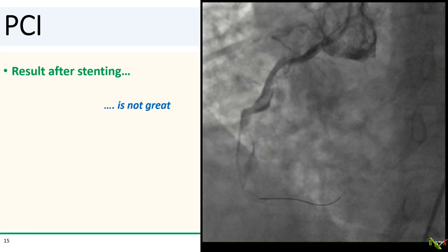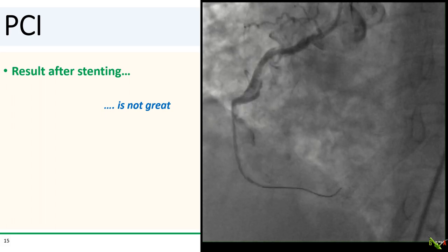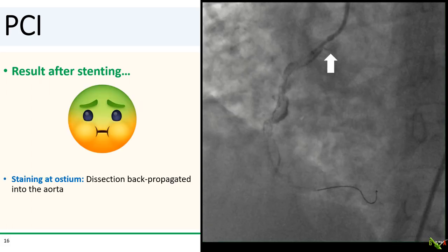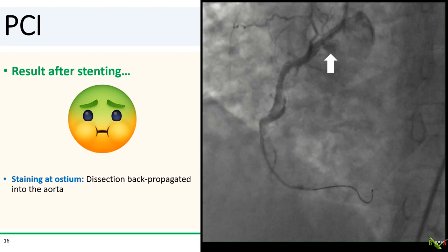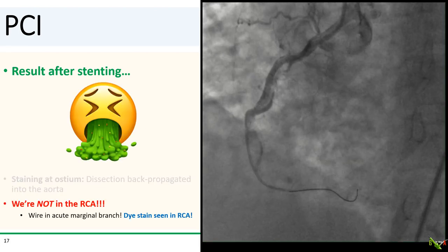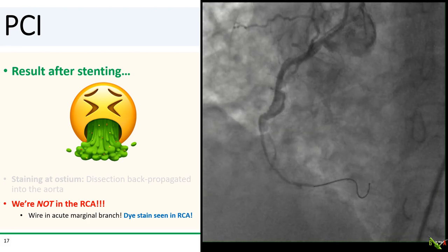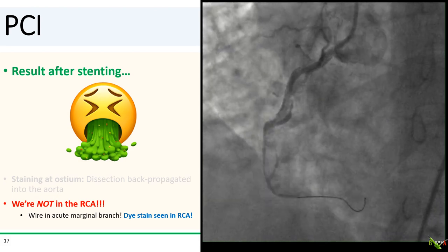Here is the result after stenting — definitely not great, but look at the angiogram carefully. We noticed some staining at the ostium and into the aorta. The dissection had propagated and dissected back into the aorta, exactly what we were trying to avoid. And even worse, we are not even in the RCA — our wire is in an acute marginal branch. You can see the dye staining spiraling down the dissection plane and tracing the outline of the RCA. A wave of nausea washed over all of us, and colorful four-letter expressions of indignation were heard all around the room.